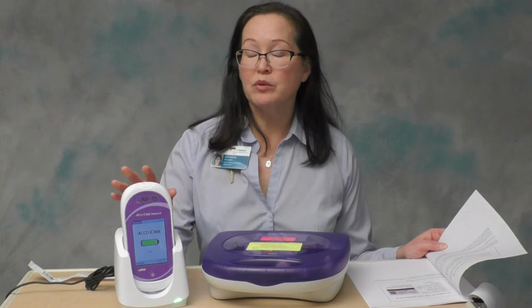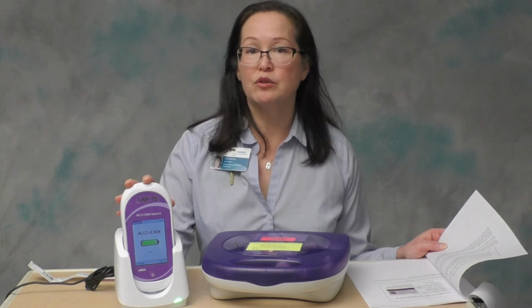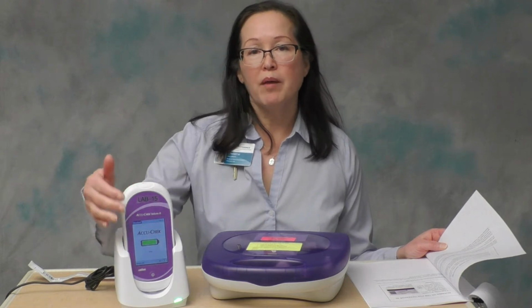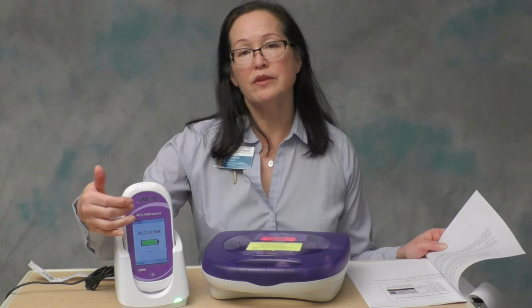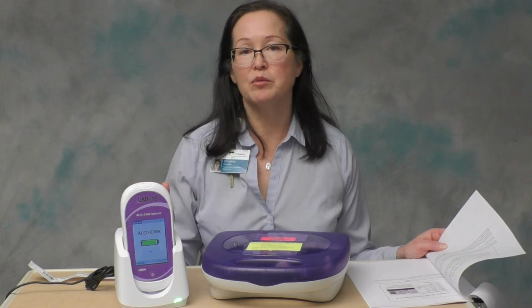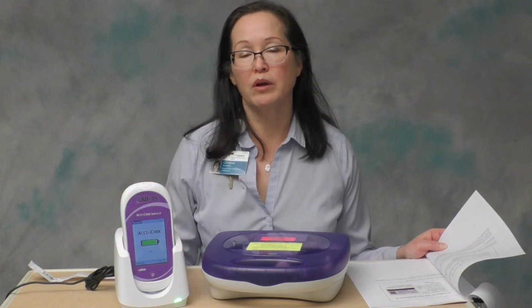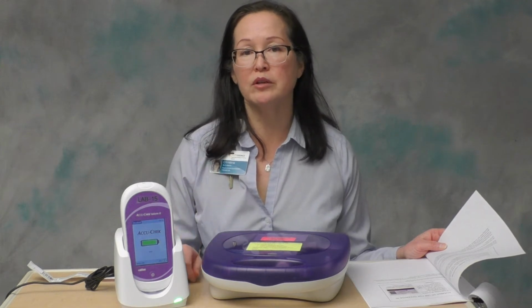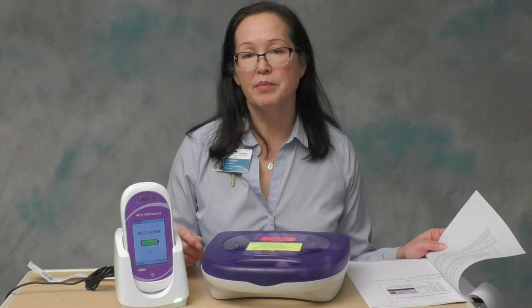And what will happen is when it's within 30 days of your certificate expiring, when you scan the meter, a pop-up message will appear on the screen that tells you your certification is going to expire in X number of days. You need to run the quality control. You need to run 2 levels of quality control every year in order to maintain your competency.